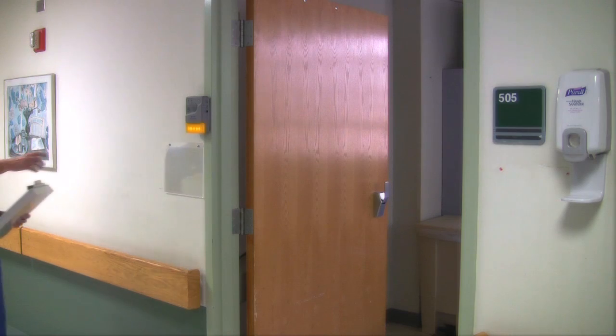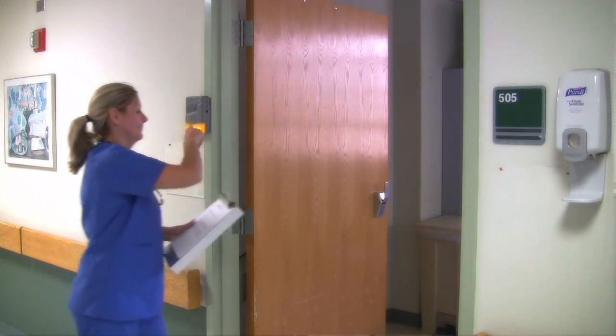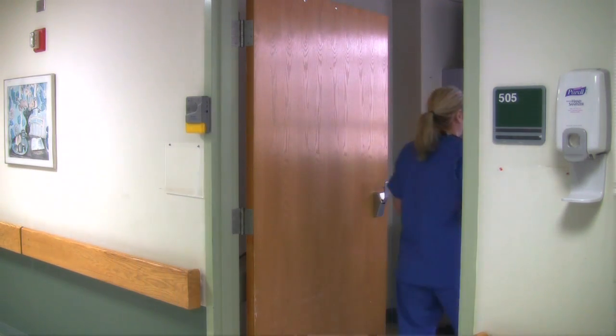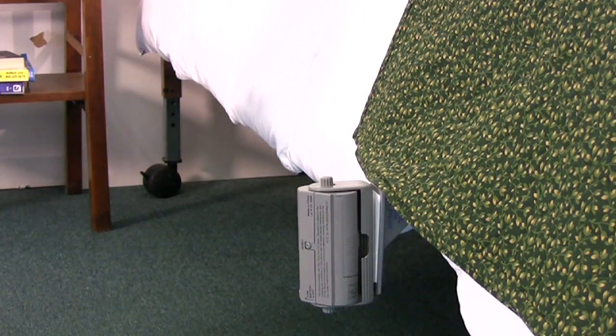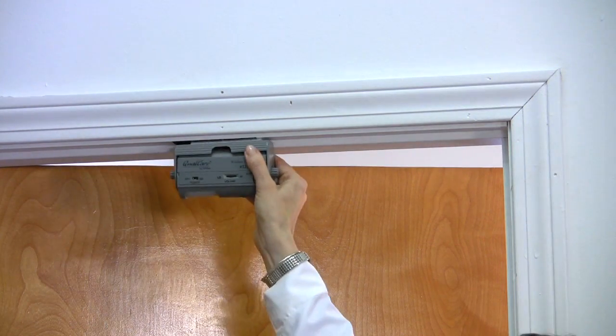It is a great choice if you're looking for the added safety of an alarm that can sound in more than one location and can deliver a further reaching warning to patients in danger of falling. It can be placed on the side or at the foot of the bed or at the headboard. You can even place it above the doorway for patients who tend to wander out of the room.